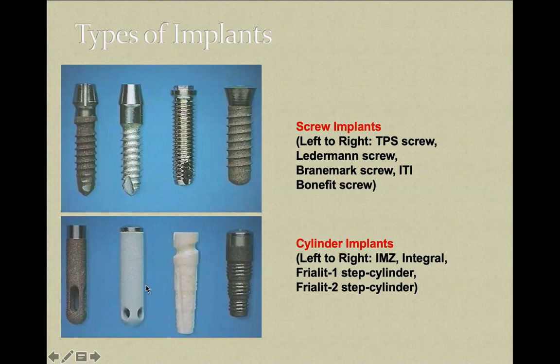But nowadays we're not using this kind of implant too much, because they might have a lot of problems. For example, if any mechanical problem occurs with that implant and you should remove it, for sure you have to cut it out. So you have to destroy the bone, then wait 2 or 3 months, then probably you might place another dental implant.